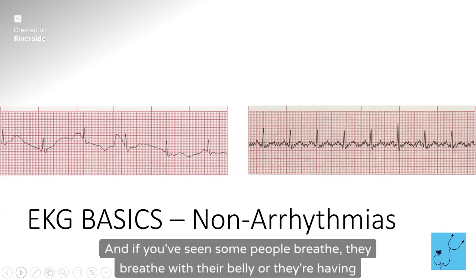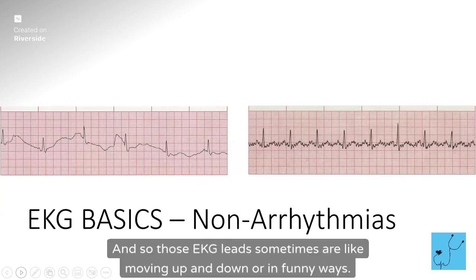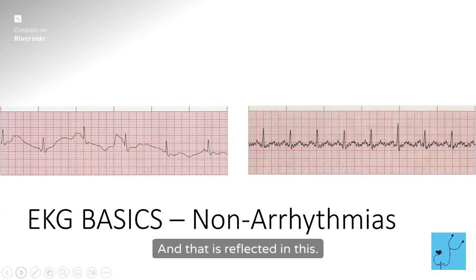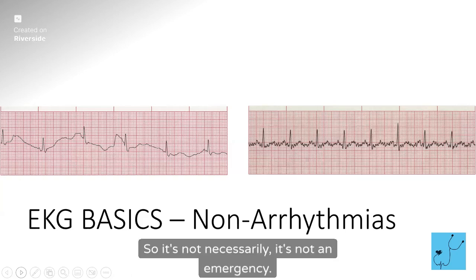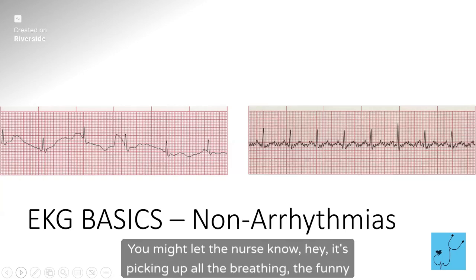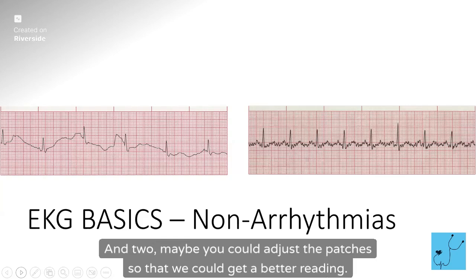And if you've seen some people breathe, they breathe with their belly, or they're having trouble breathing. And so those EKG leads sometimes are moving up and down or in funny ways. And that is reflected in this. So this would be called respiratory artifact or respiratory waveform. So it's not an emergency. You might let the nurse know, hey, it's picking up all the funny breathing your patient's doing. One, is that normal for them? And two, maybe you could adjust the patches so that we could get a better reading.